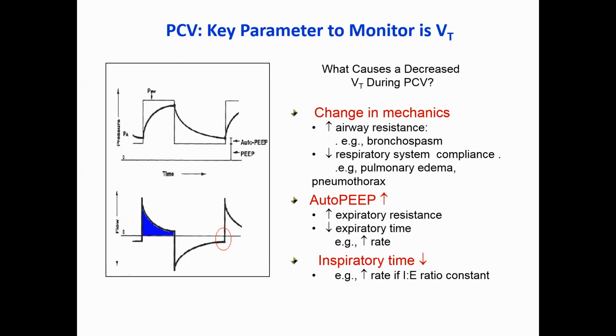I know the general principle is that whatever ventilator mode achieves all of your goals is the best one for the patient in that situation. But you choose something, you intubate, the patient's intubated. Do you have some go-tos based on patient situations? I mean, you start with something. So it depends on the situation that you're talking about. Actually, next time we'll have some examples.